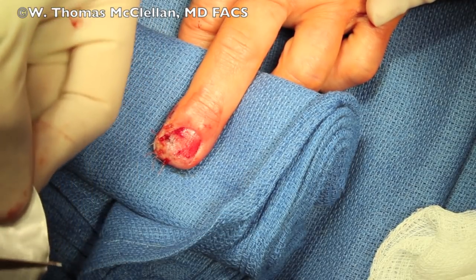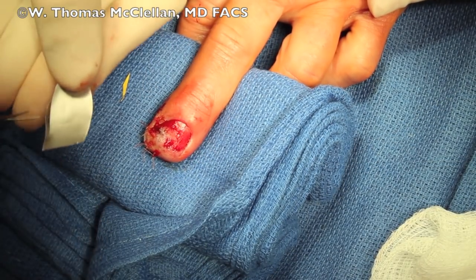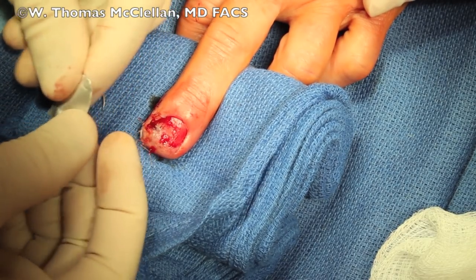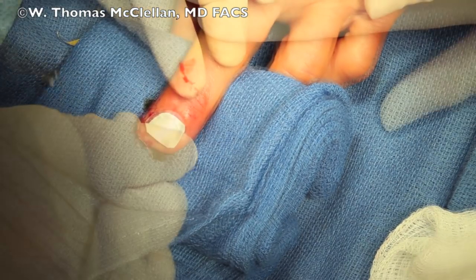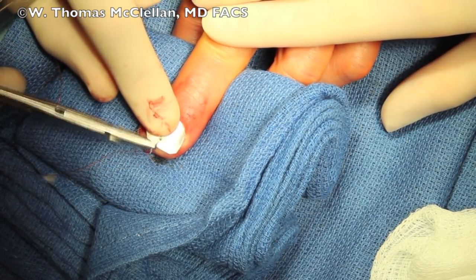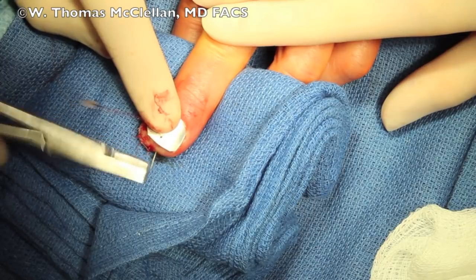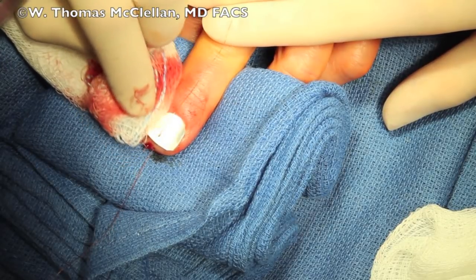It's great to have a splint that can go under the eponychium where the germinal matrix lies, and it serves as a splint in order to help the nail plate grow back out unobstructed. So it's important to splint the nail. You trim the suture foil to fit and then gently slide it up under the eponychium. I generally secure it with a plain gut suture that will last a few days to stabilize the splint, using just one suture through the tip of the nail.